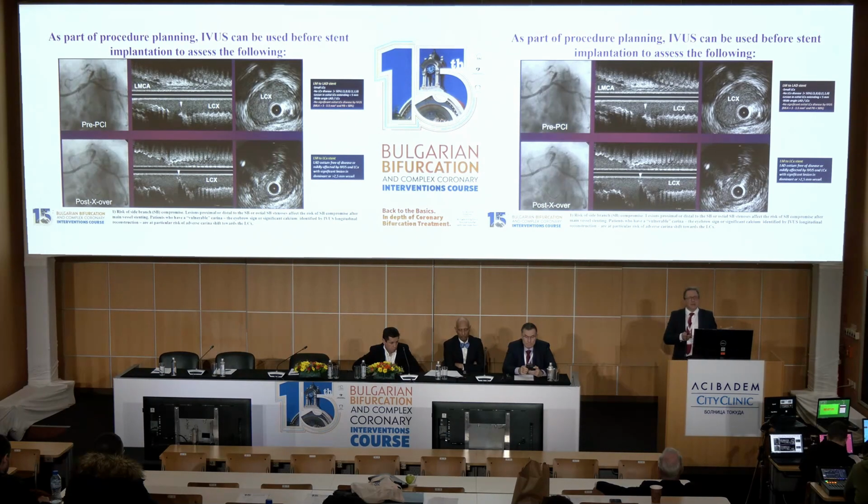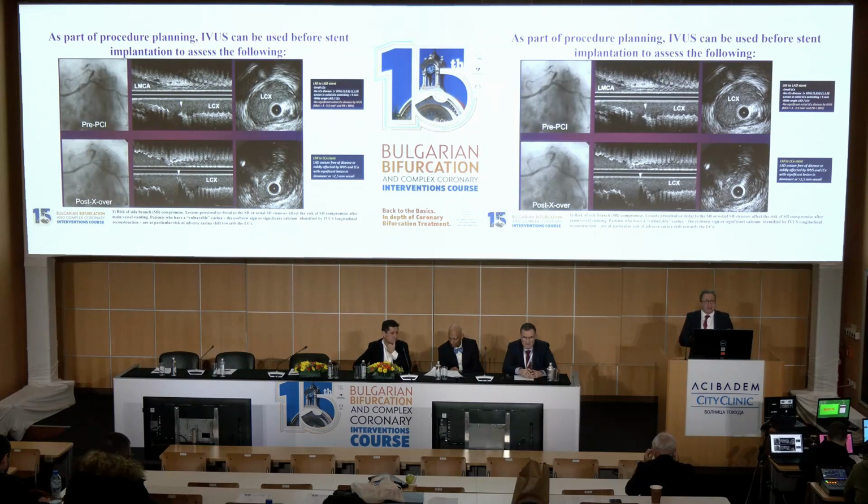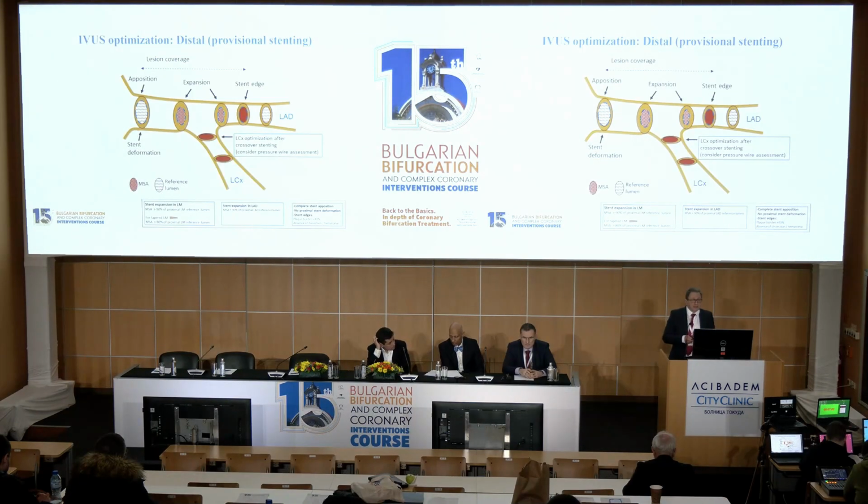Because left main is not just one vessel, but a complex of three vessels interfering, not only due to the angulations, but also due to the atherosclerotic process, which can be discovered and assessed by intravascular ultrasound very, very easily. Based on these results, we can really design a proper protocol for particular patients.